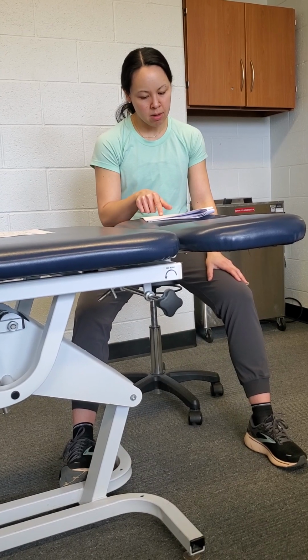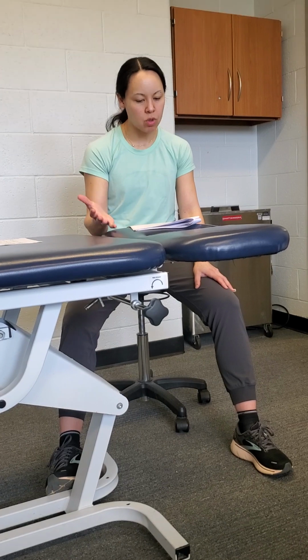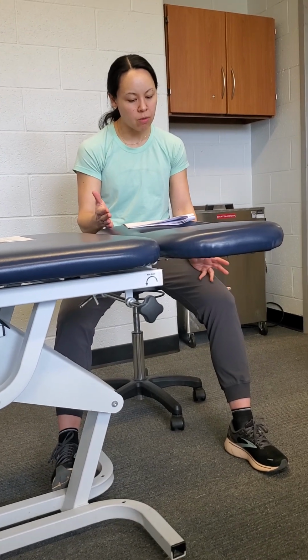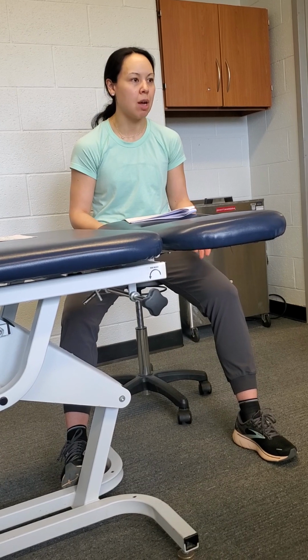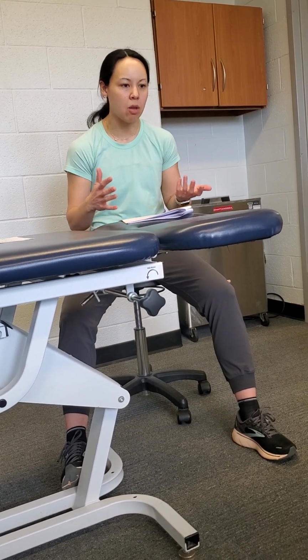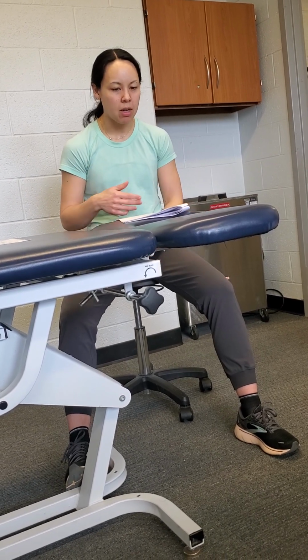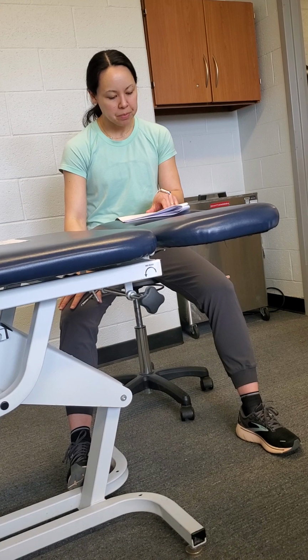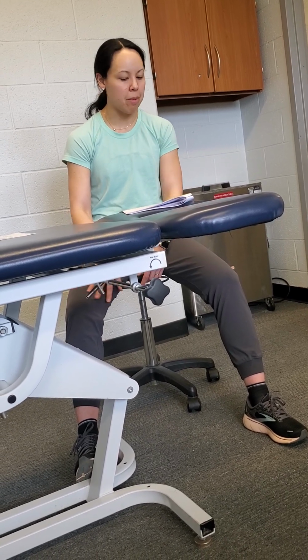And then let's see. So the general takeaway if you're doing it passively in the acute phase is to let the tourniquet do the work for the first 1 to 2 weeks post-op. They don't have to do anything. If they can tolerate some quad sets or ankle pumps or glute sets, they can certainly do that, but just let the tourniquet do the work. And that's what this talks about down here too, it's just the parameters again.